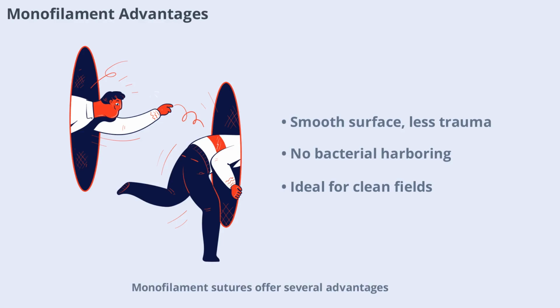Monofilament sutures offer several advantages, including a smooth surface that minimizes tissue trauma and prevents bacterial harboring. Their single-strand design ensures easy passage through tissues and reduces the risk of infection. However, their delicate nature requires careful handling to avoid damage. These sutures are particularly useful in clean surgical fields where minimizing tissue reaction is a priority.